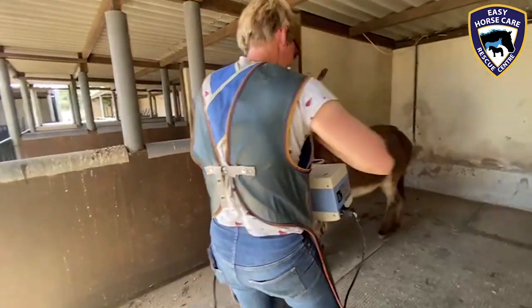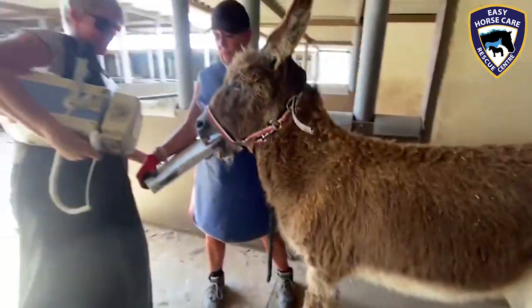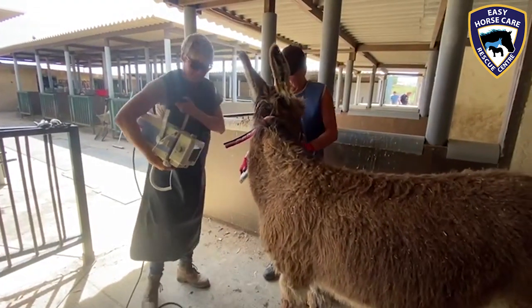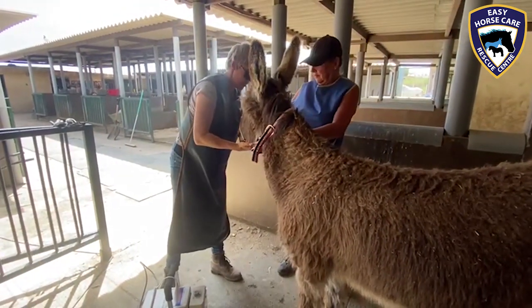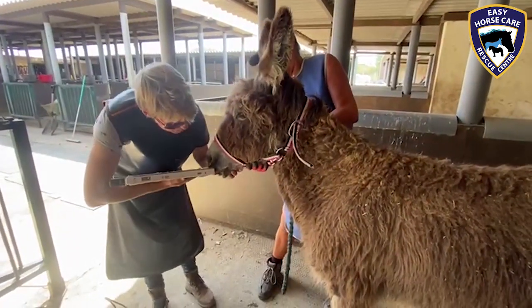Well here we are at Easy Horse Care Rescue Centre. Very busy day here today. Several x-rays have been done and we're now in the process of x-raying Marley the donkey to determine the best way forward to remove her rotten tooth.